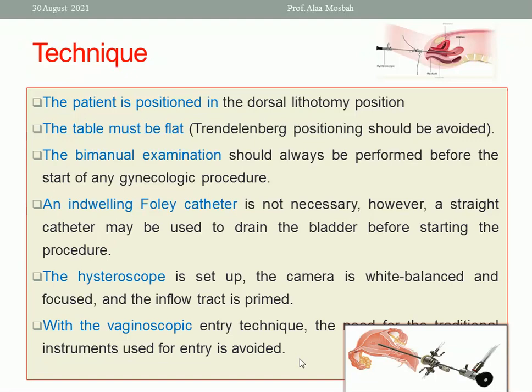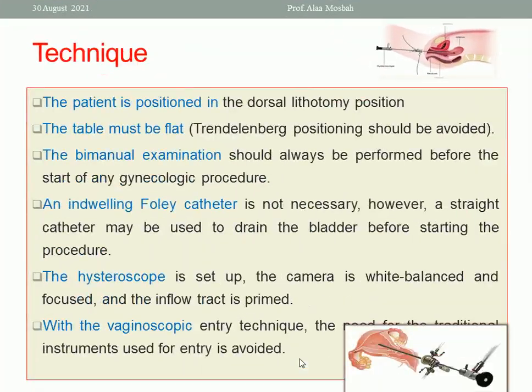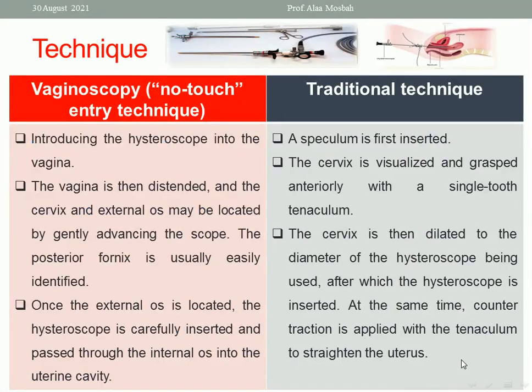But in traditional hysteroscopy, I use these. So this is the difference between vaginoscopy, the no-touch entry technique, and the traditional technique.